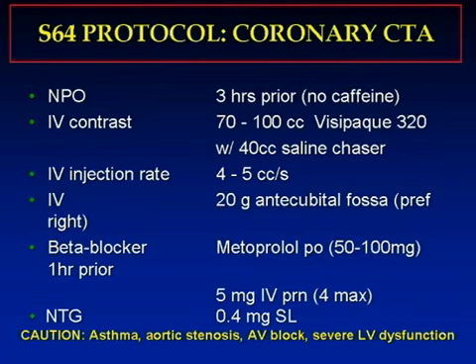We are very aggressive in terms of beta blocking our patients. We try and achieve a heart rate in the mid-50s if we can. And I found that the oral metoprolol really is the best way to start. If these patients come in with a heart rate of about 65 or greater, we'll generally start with oral beta blocker because I think it works better to start with than the IV.